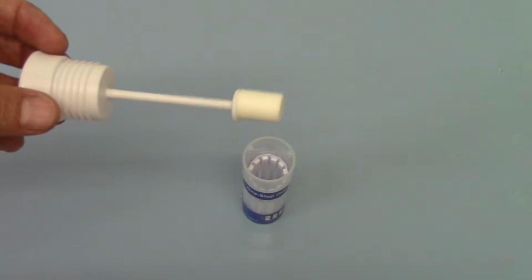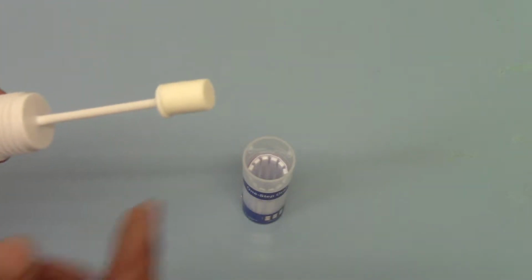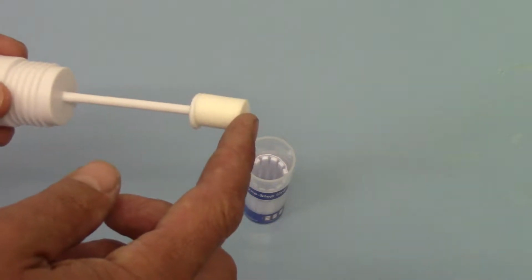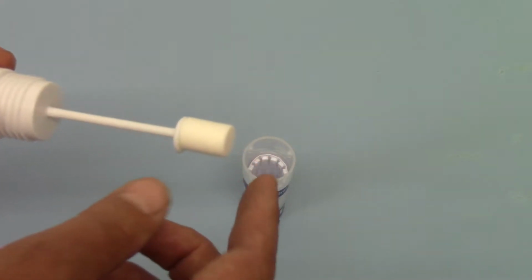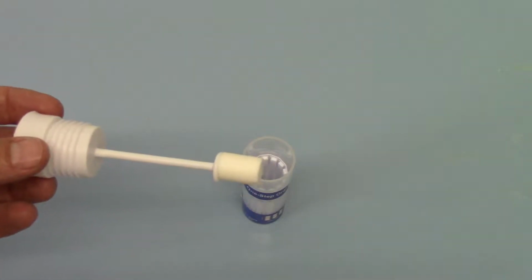Now the swab you'll see here comes out of its cellophane wrapping. It's firm and rigid initially. This bit has to be completely saturated in saliva and oral fluid. It will go very soft and squishy at that stage and allow you to compress the test.